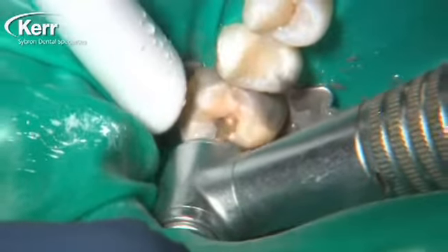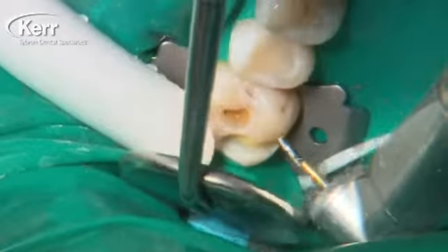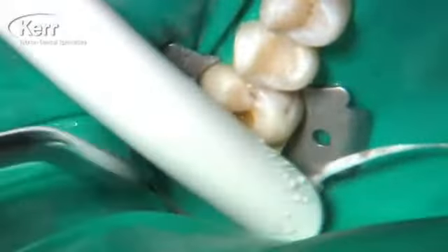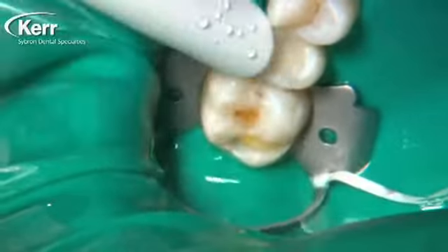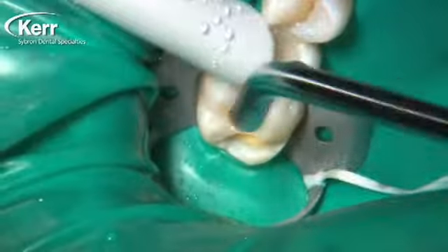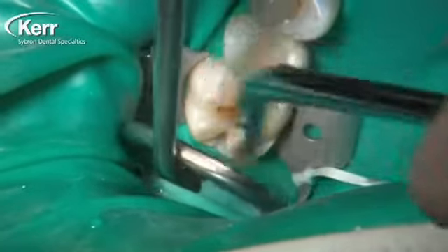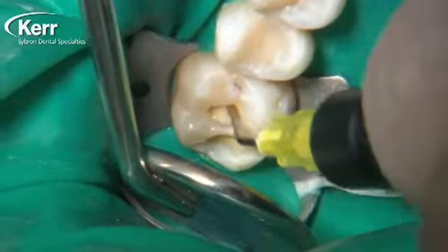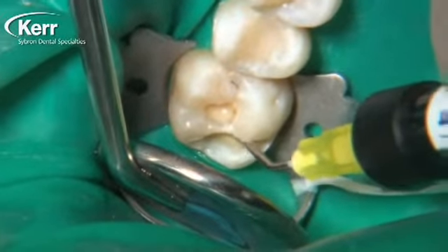We're moving to the tooth behind it — a small class one occlusal restoration and a two-surface OL restoration. If you pay attention to the steps involved with Vertice Flow, some of the more technique-sensitive steps, especially bonding agent application, are removed, which takes a lot of the guesswork out of direct composites. Look at that — five seconds of air being blown right onto those preparations. That's counterintuitive if you've been doing composites for a while, because we've been taught that dry dentin is not a good bond. That's really one of the big steps forward with Vertice Flow.